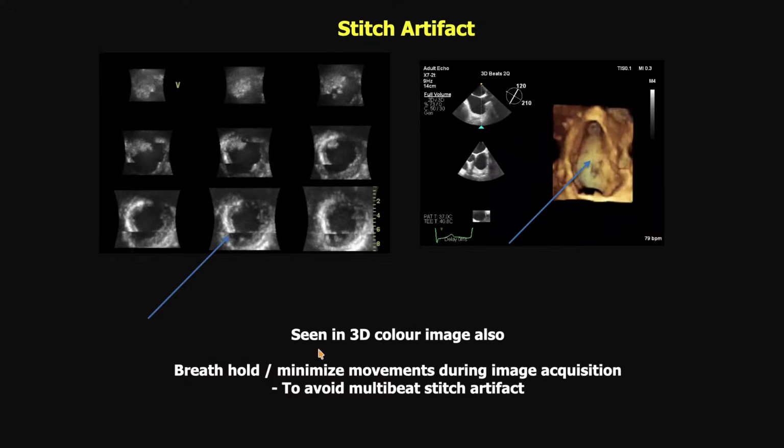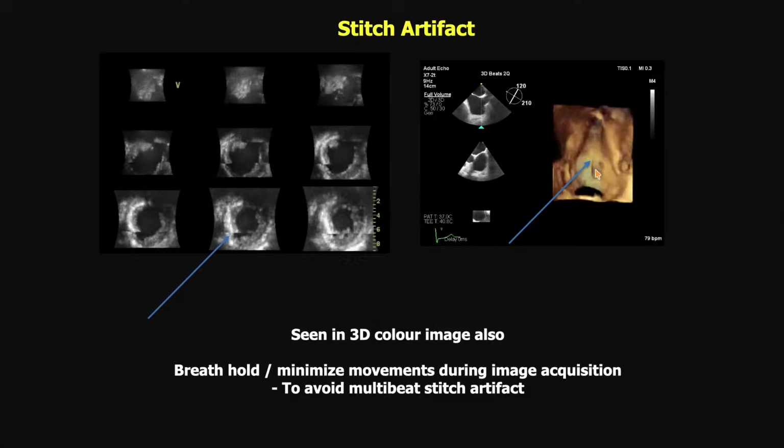And again, you can see that there's a crack in the 3D image. It's not really a true pathology. That's because it has been taken as multi-beat. So I'm telling you the advantages and disadvantages. Be careful how you look at it and how you acquire it.